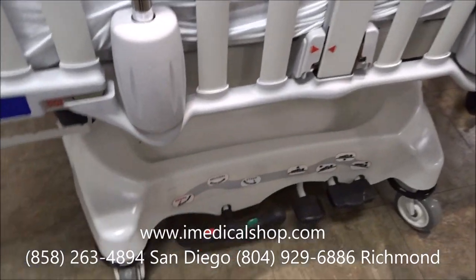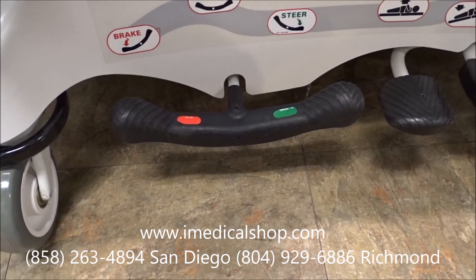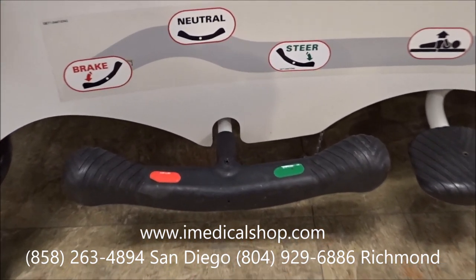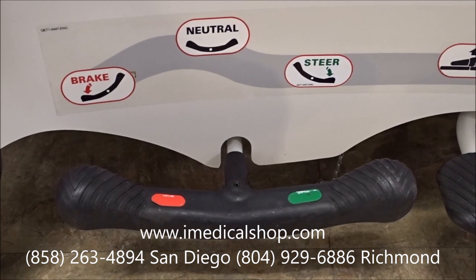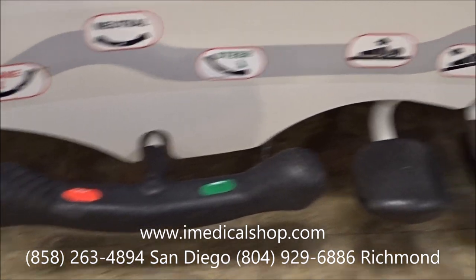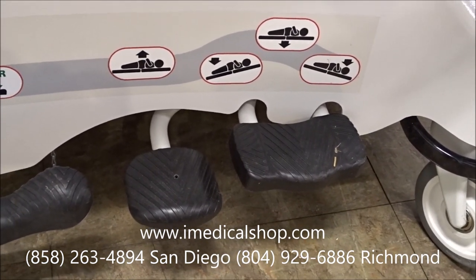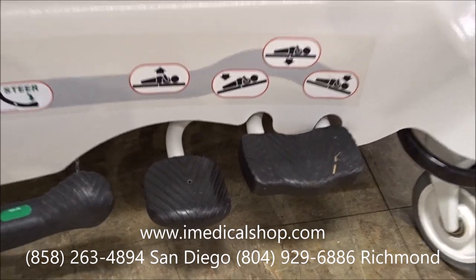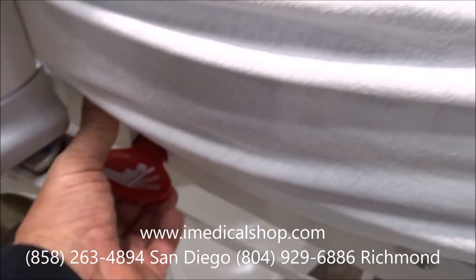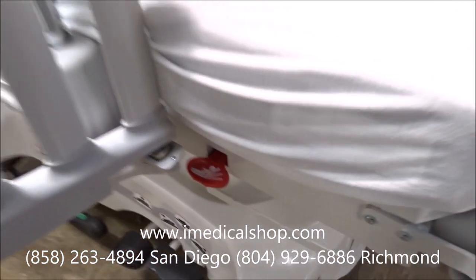Now, this unit has basically a stretcher base to it. So you have the normal functions that you're going to have with the stretcher. If you have to push or move it around, you can lock out the steer. That's going to drop down a fifth wheel. And then you also have your Trendelenburg, reverse Trendelenburg, and your kick pump to adjust the height. And then you also here on the inside have the option of raising the head section up. So that's also an additional feature that goes with this.